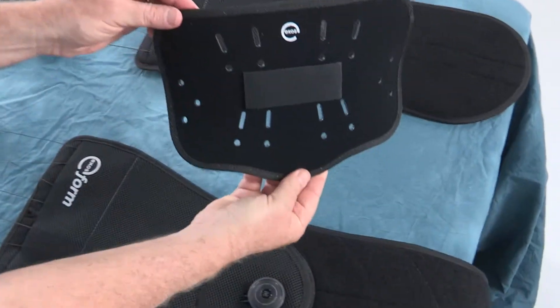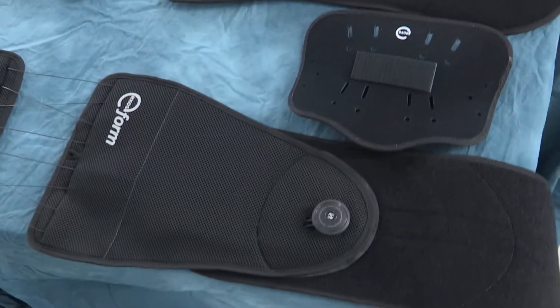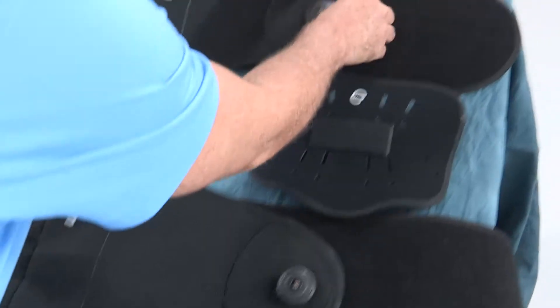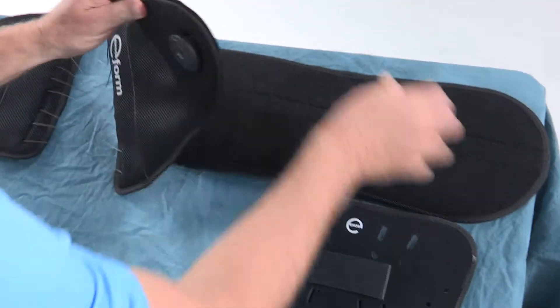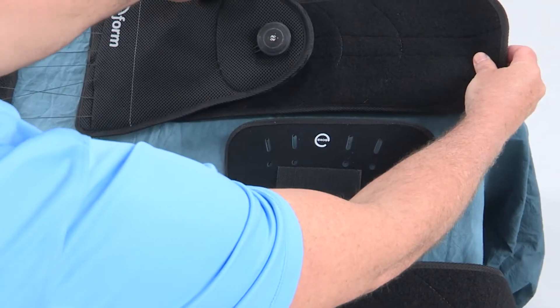When sizing the ExosForm, reference the instructions for use for belt dimensions and sizing guidelines. In the event that your initial sizing estimation is not perfect, you can make adjustments to the circumference or angle of the belt wings while the brace is being worn by the patient.